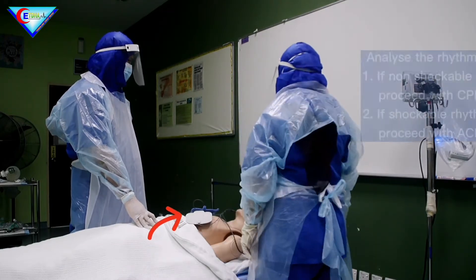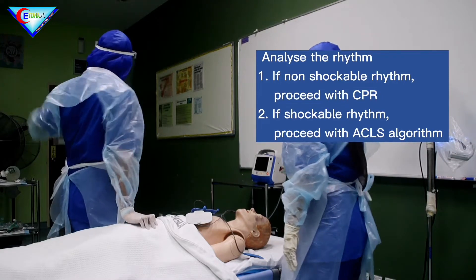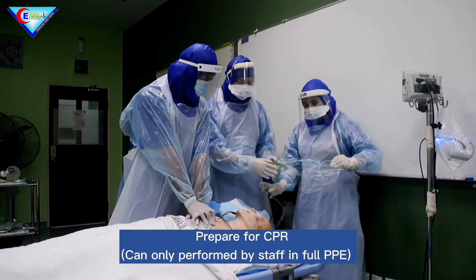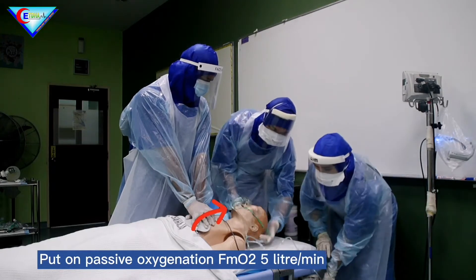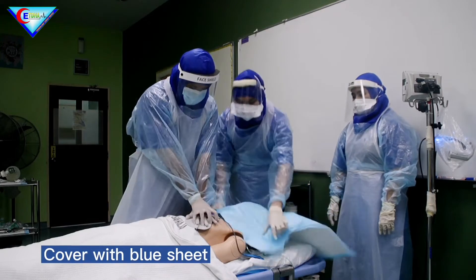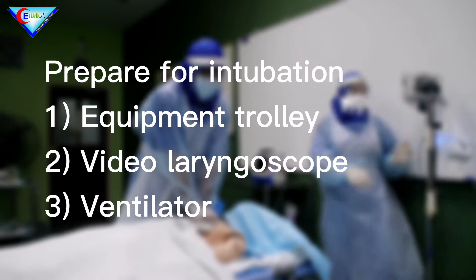Analyze the rhythm — asystole. Prepare for CPR. Put face mask. Cover with blue sheet. Start CPR. Prepare for intubation.